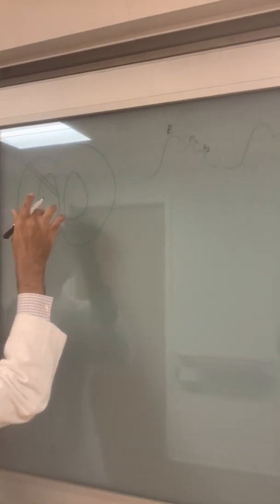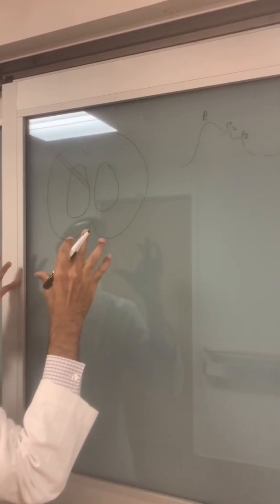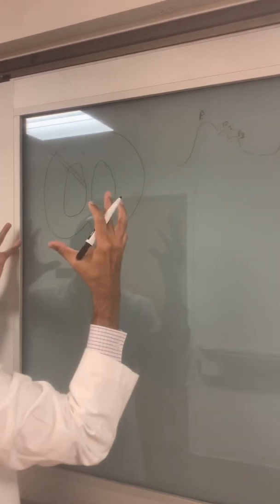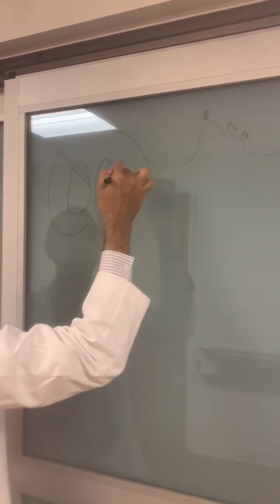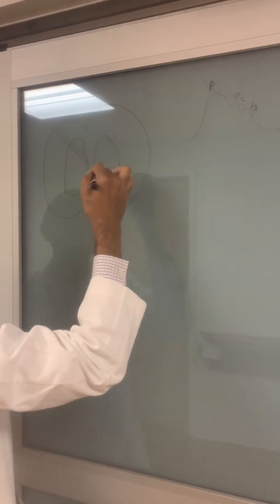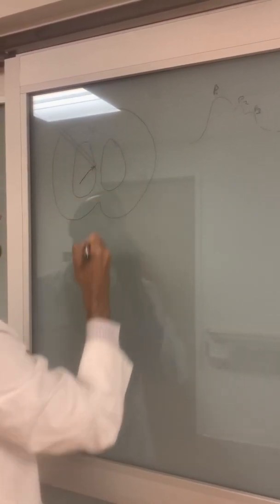When you're thinking about the EVD, the pressure will come here. When your heart pumps, all of the blood in the body will shoot up to the brain and cause an increase in pressure in the brain. The pressure is then distributed through the vasculature, the brain parenchyma, and the CSF, and hits the EVD, and you get that first bump.